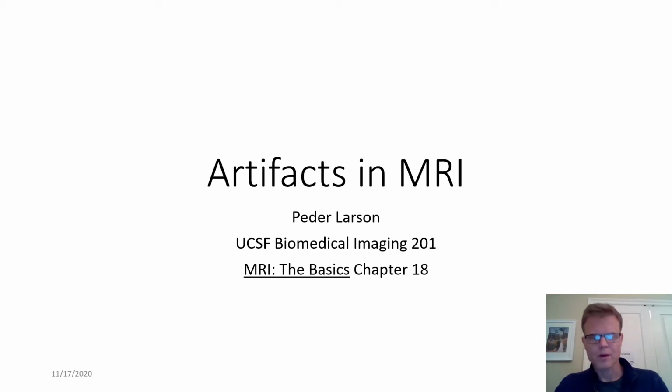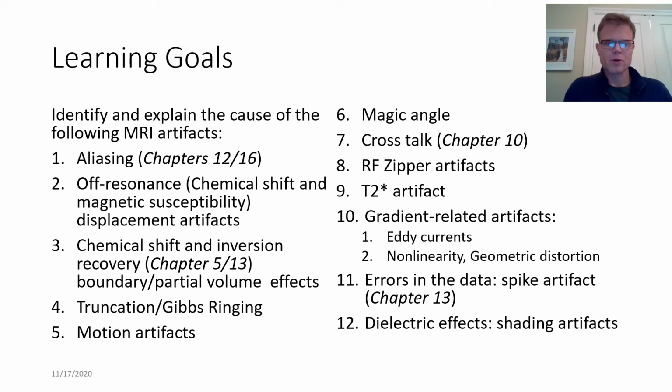Hello everyone. Welcome to the lecture for MRI, the Basics, Chapter 18, which is all about artifacts in MRI. There's a bunch of different artifacts we can encounter in MRI, a few of which I've seen already, and I've tried to annotate that here, but a number of new ones that we'll introduce in this chapter.